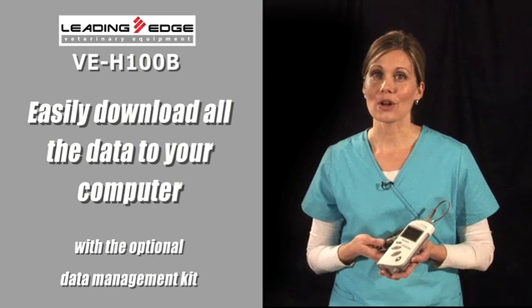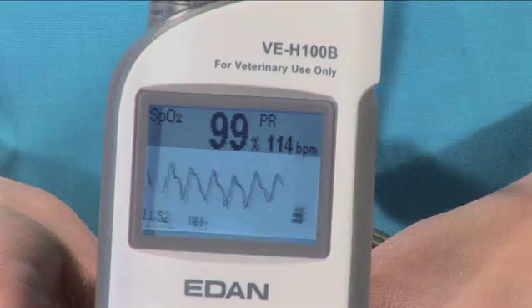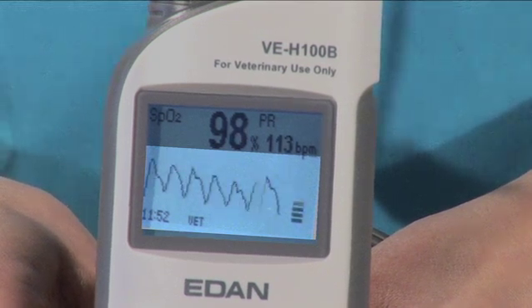With the VEH-100B, you can easily download all the data with the optional data management kit. The plethysmographic waveform is one of the most critical indicators of cardiac activity you must know to monitor how your patient is doing.